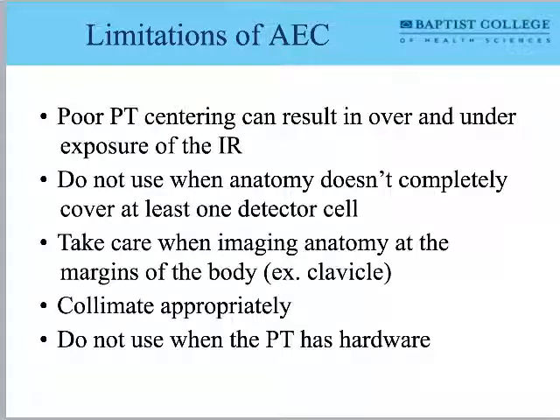So it's here to help you, but there are some limitations to it. Those are stipulated here on pages 416 and 417 of the textbook, and I've shortened them and placed them on this slide. Basically, make sure you center appropriately, make sure that the anatomy covers the AEC cell completely, and make sure that it's not on the periphery of the body.